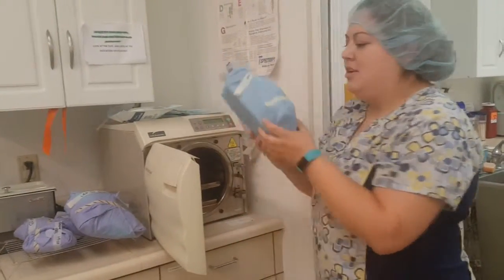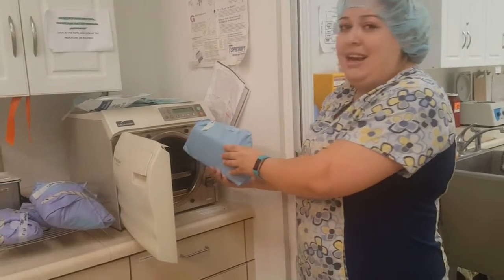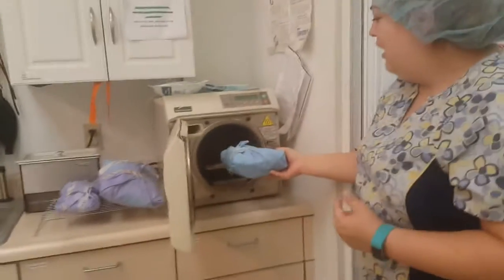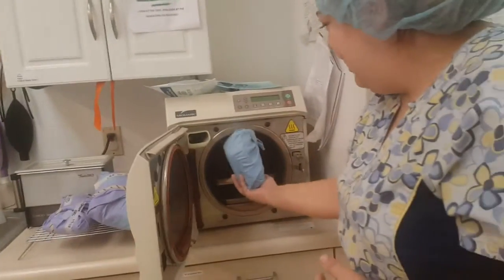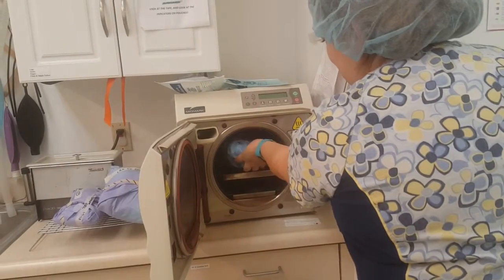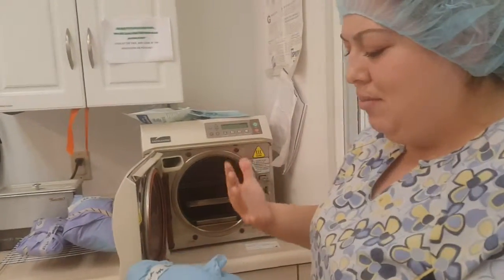Any packs that you use should always be laid on their side. You never want to lay them flat or upside down because the steam can't go through them properly.